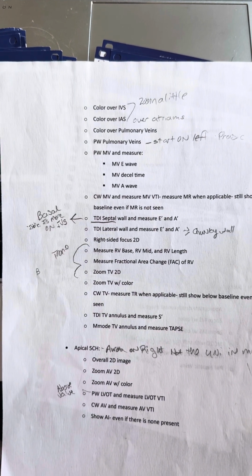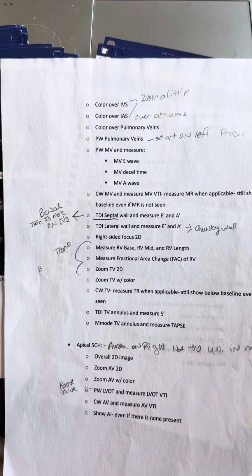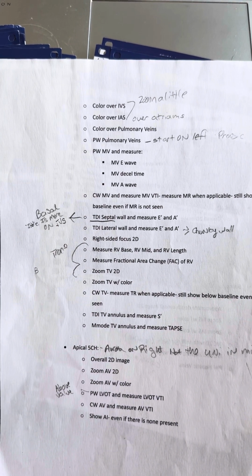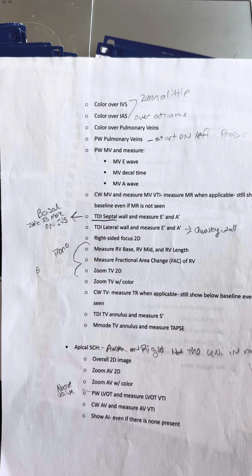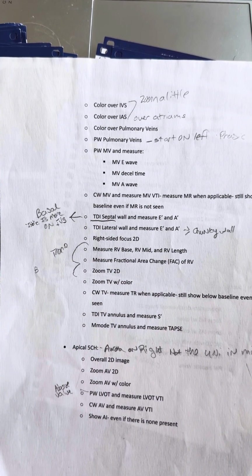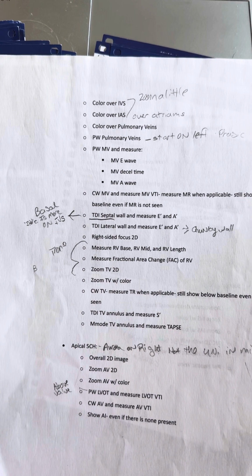You will then move to your right side and focus this. You trace and measure your RV base, your RV mid, and your RV length. Measure fractional area change of your RV.